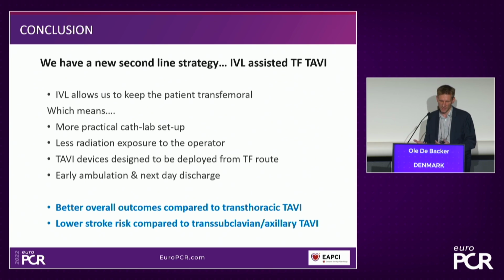Everybody, it takes much more time. You take much more radiation as an operator too. Here you can just stay transfemoral. You're not standing in that X-ray beam like you're doing transaxillary or transcarotid or whatever approach you want. Also, the TAVI devices are designed to be deployed transfemoral, so it typically works best via the transfemoral route, and you don't have any surgical wounds, etc. You can keep it fully percutaneous.